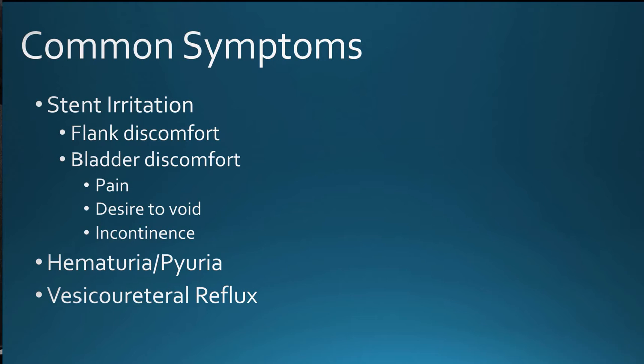including just painful discomfort, but also urgency, sometimes even incontinence. They irritate the bladder lining, creating hematuria and sometimes pyuria, and they reflux. They cause the ureter to reflux. Some of the newer stents, some of the research into the newer stents have some kind of valve mechanism to try and prevent this reflux.